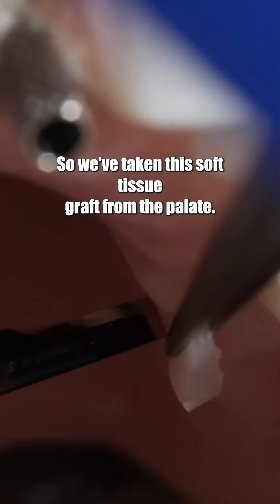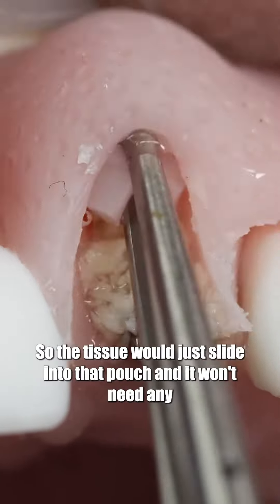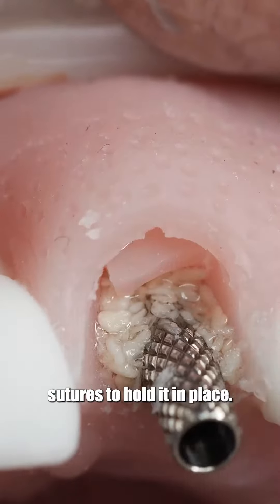We've taken this soft tissue graft from the palate. We raised a little pouch with a scalpel earlier so the tissue would just slide into that pouch, and it won't need any sutures to hold it in place.